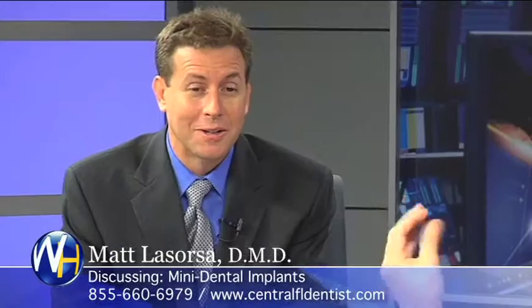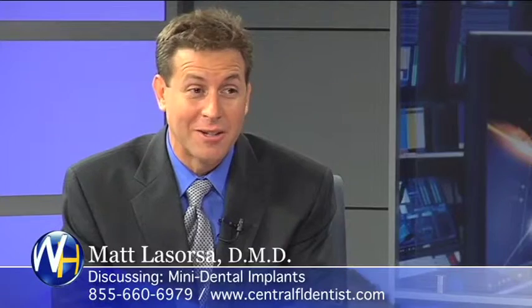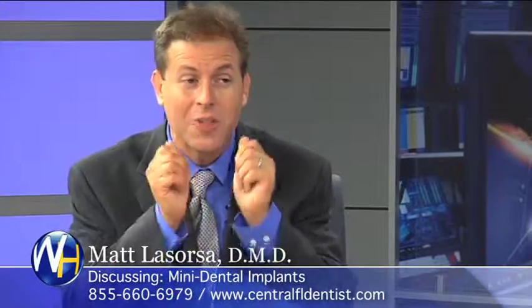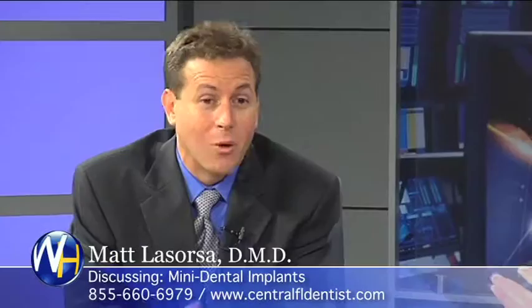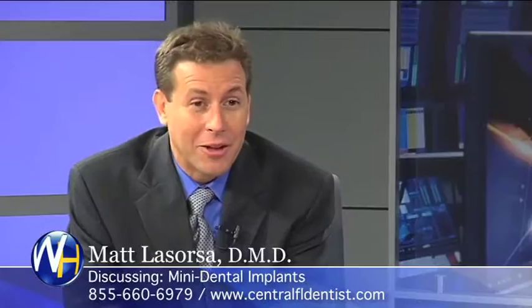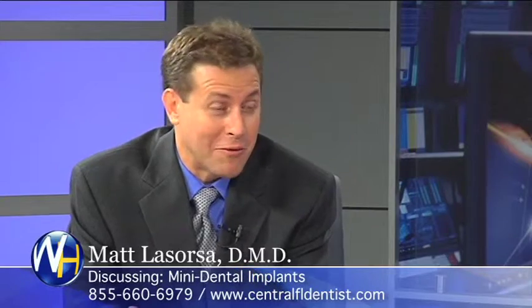You were saying that sometimes they're so snug, they can't even take them out. Yeah. You have to adjust them. So sometimes that's a little embarrassing. They come in and they can't get them out themselves. So they come in, so we have to loosen it a little just so they can get them in and out. Okay. So you almost laughed when you tell that story. Mm-hmm. So that's kind of funny. Well, I'm kind of proud that they stay in that well. Oh, is that right? Well, not that I don't want them to be able to get it out, but that means we have a pretty secure fit.